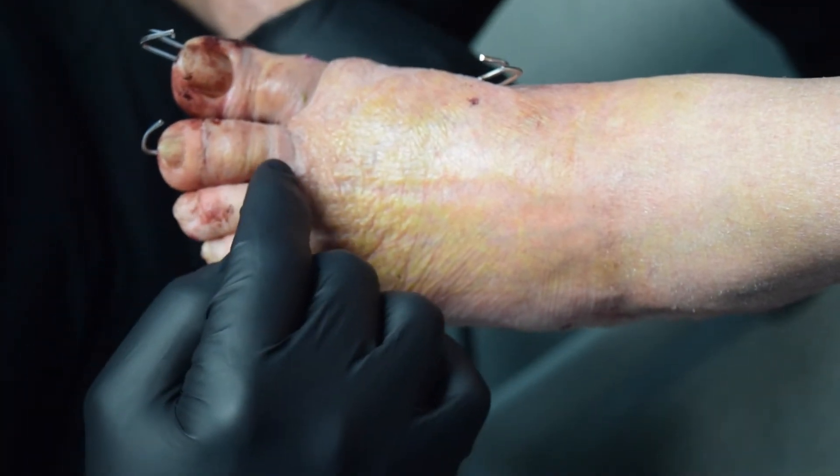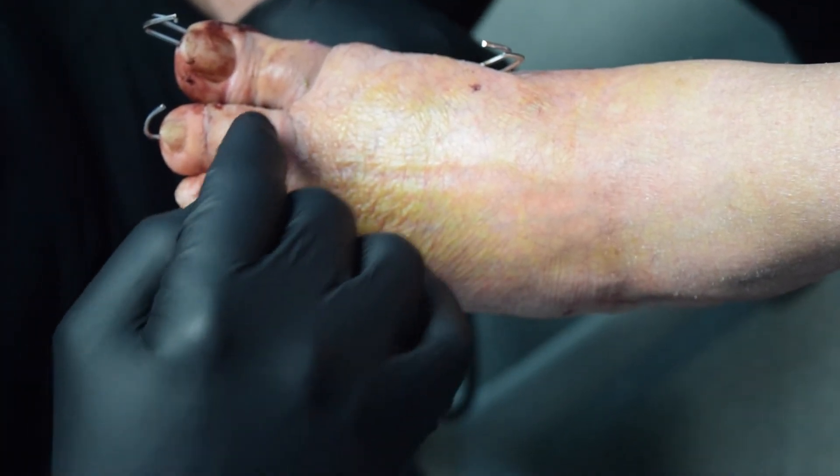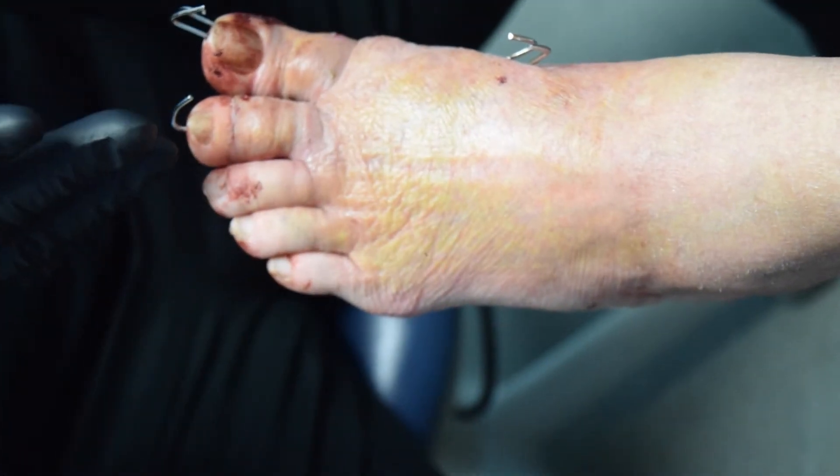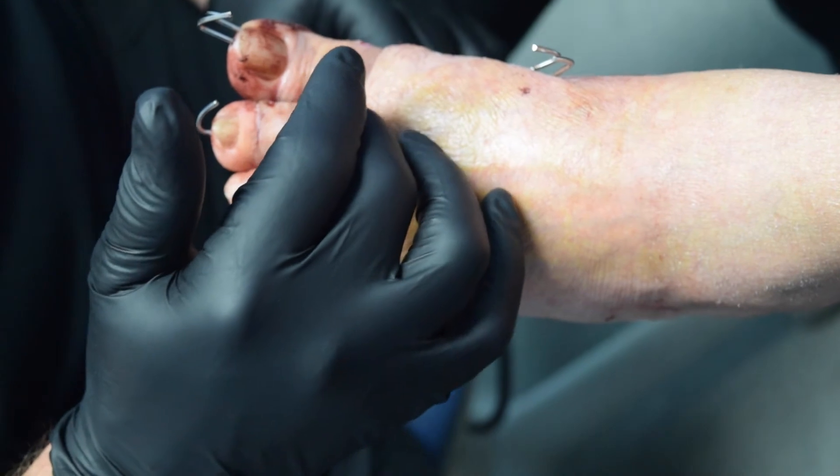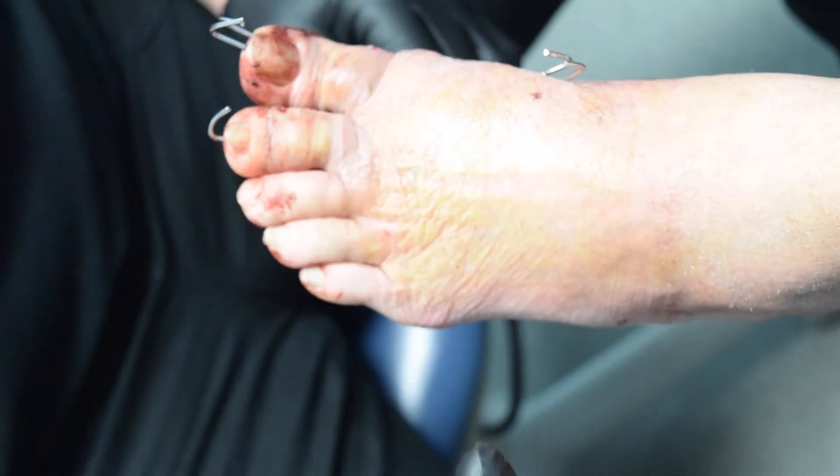Her second toe is slightly swollen because we had to perform multiple osteotomies, which moves it immediately, and we're keeping that in place with this fixation. Because the fixation is partially outside of the bone, you do have some swelling with this, but not a lot of pain.